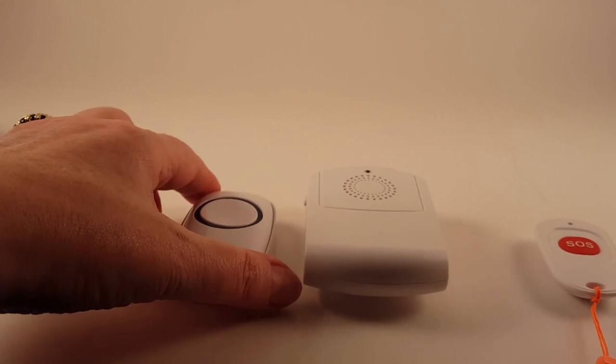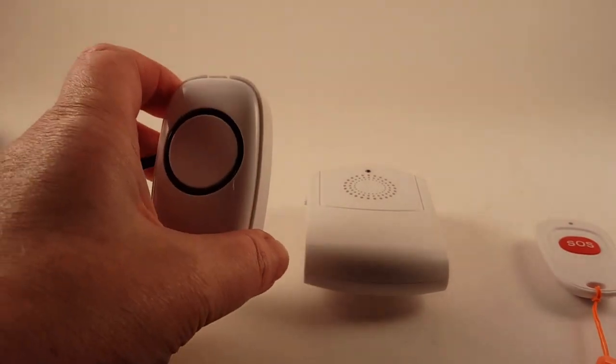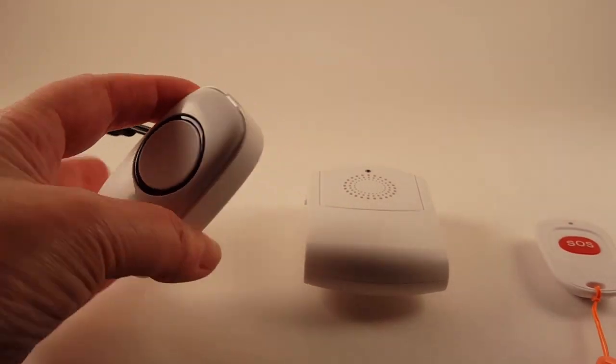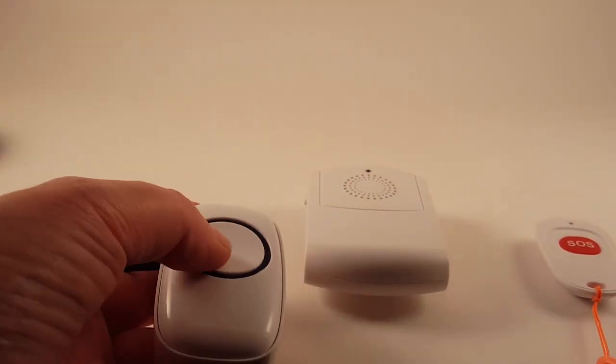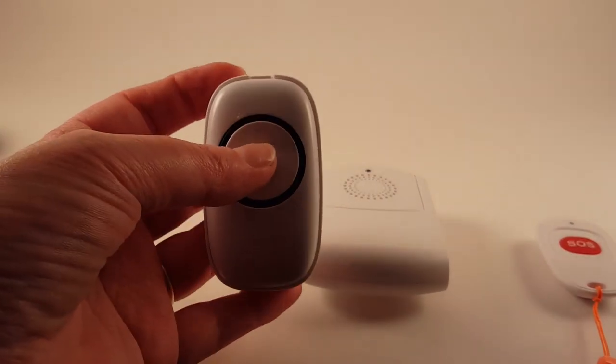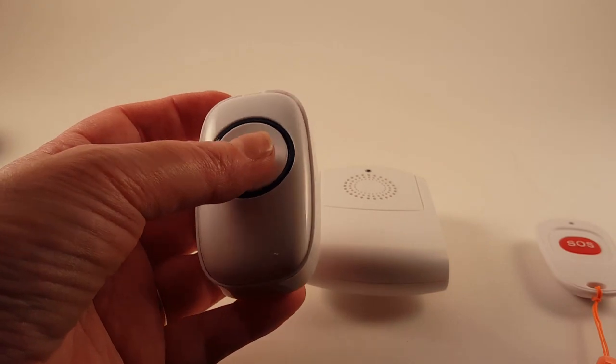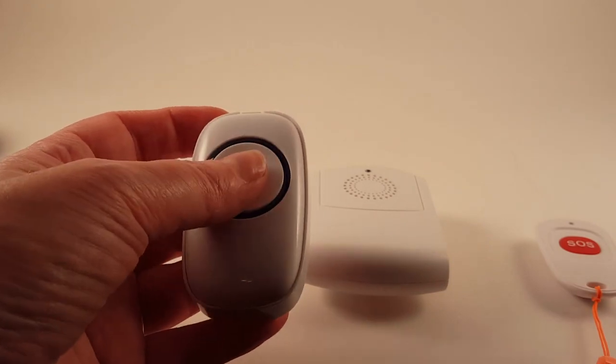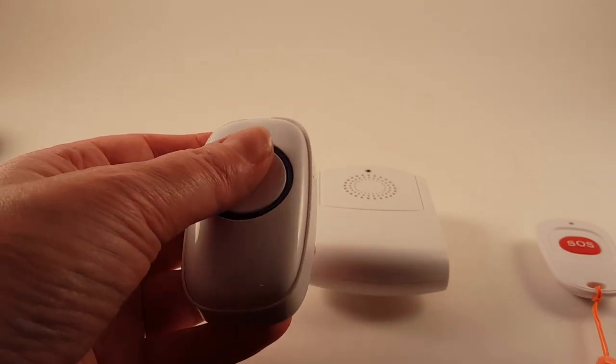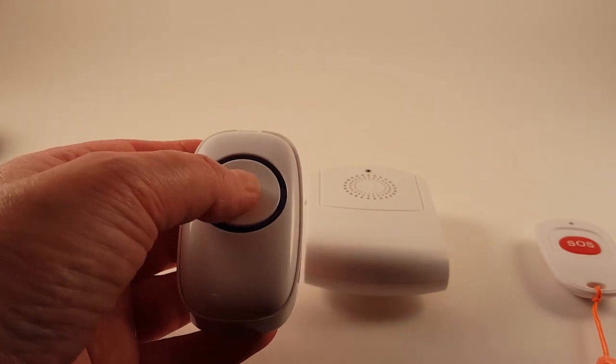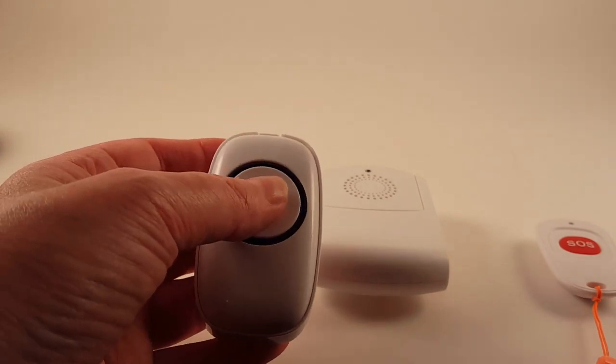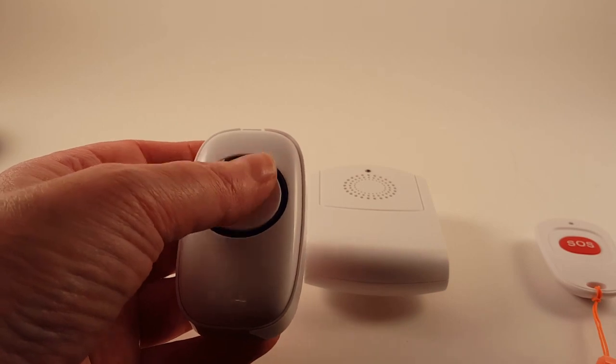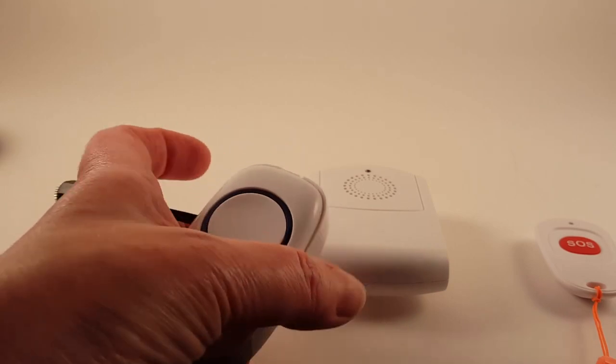So with this transmitter, it's got a nice big button on it, so for individuals who've got good hand function or fair finger function, they can just press this button directly in order to activate the chime.